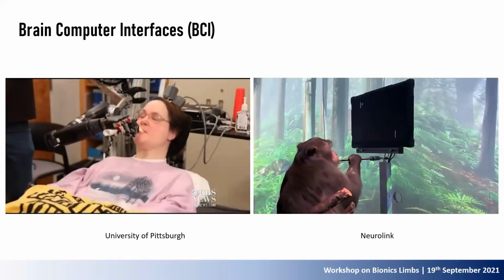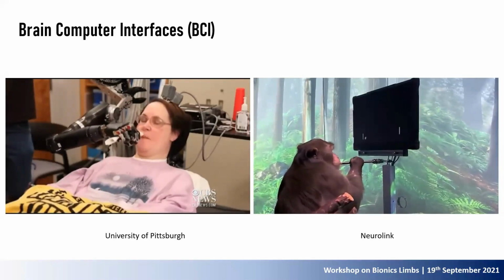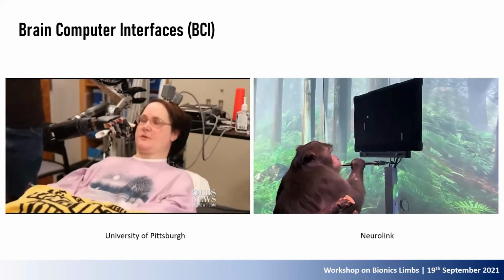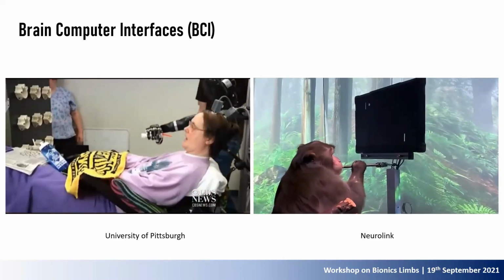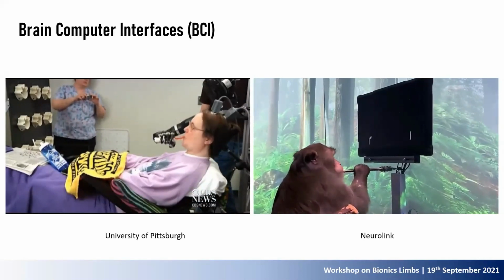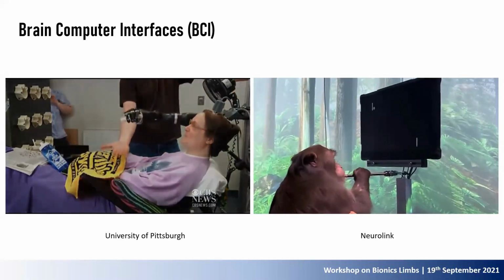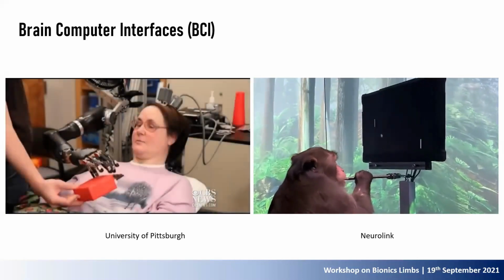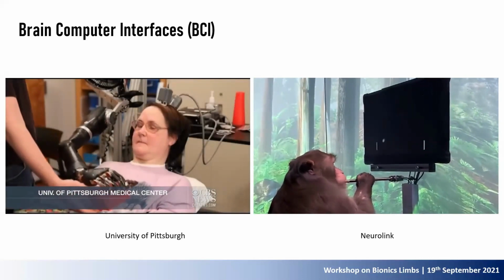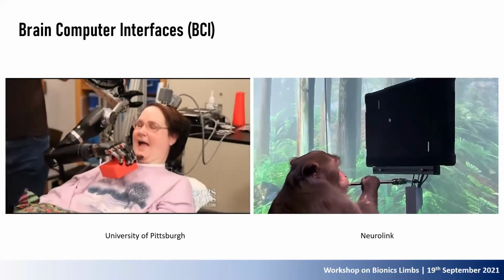If you closely watch these two videos, you may notice that they used invasive electrodes for capturing brain signals. Invasive sensors require surgery to open the brain, and then you have to place that sensor array or electrode array onto the brain itself. The reason is that this process is complex, very expensive, and also comes with a lot of risk.